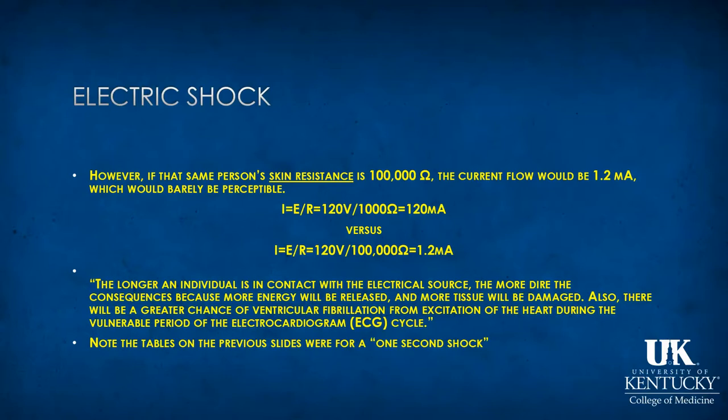Just to quote a statement from one of the references, the longer an individual is in contact with the electrical source, the more dire the consequences, because more energy will be released and more tissue will be damaged. Also, there's a greater chance of ventricular fibrillation from excitation of the heart during the vulnerable period of the electrocardiogram. Just to remind you that all the tables on previous slides were for a 1-second shock.